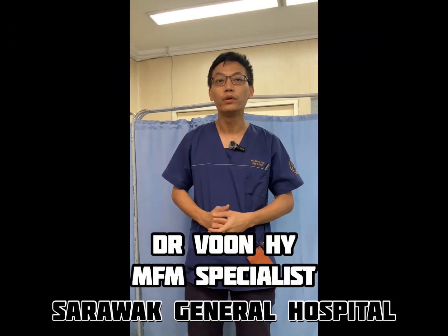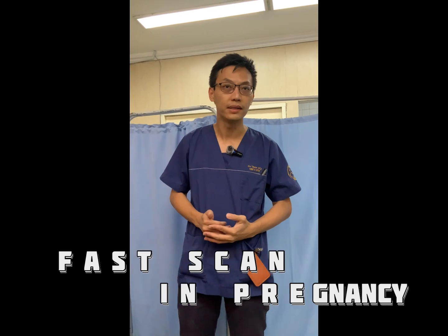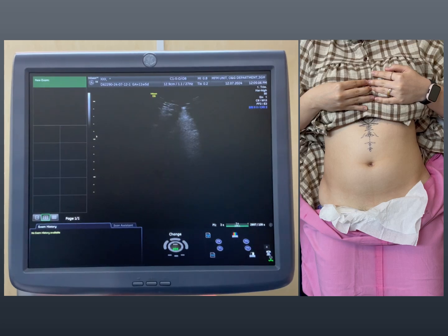I'm Dr. Voon, and today, on behalf of the Intensive Course of Obstetric Emergencies, ICO, I'm going to demonstrate to you how we perform a fast scan in pregnancy.